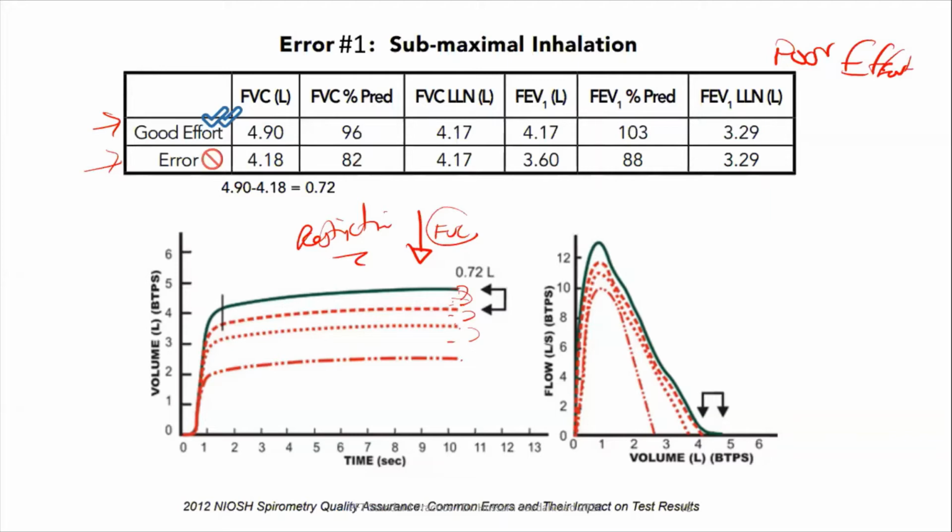And the patient did not inhale to the maximum, most commonly due to improper coaching. So always make sure that you coach the patient well. I need you to inhale, I need you to fill all the air, I need you to fill your lungs with the air as much as you can. So this is going to be the solution. Coach the subject to fill their lungs. You take the deepest breath that you possibly can. I need you to take the deepest breath that you possibly can. So this is the solution.